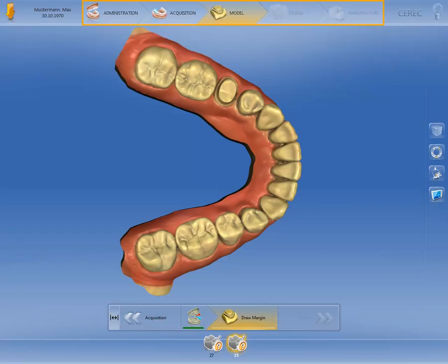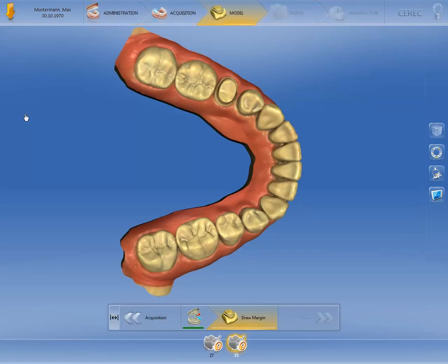You will see the phase bar in the upper part of the CEREC software user interface. The workflow is divided into five phases: Administration, Acquisition, Model, Design, and Manufacture. The active phase is always highlighted in orange. The phases must be processed chronologically; however, you can return to previous phases at any time in order to make retrospective changes.